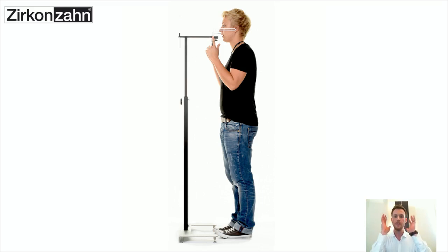From this position we are able to register the head and transfer, because usually the maxilla is attached to the head, logically, and via the head position we are able to transfer the maxilla position into the articulator device. How does it work? Step by step, shortly explained.